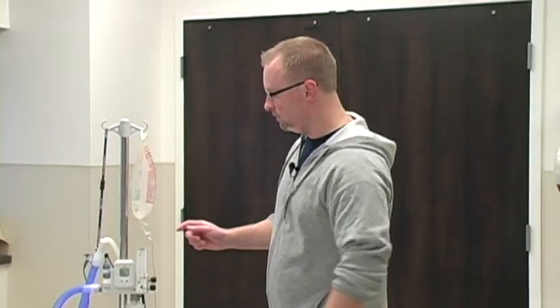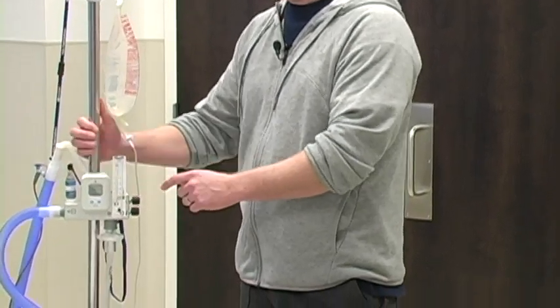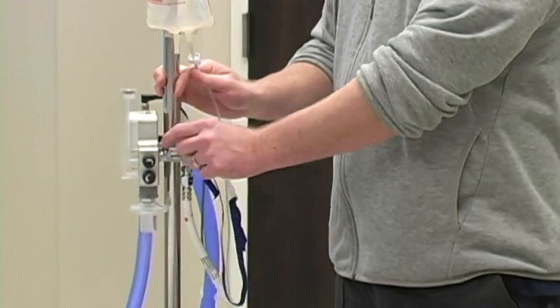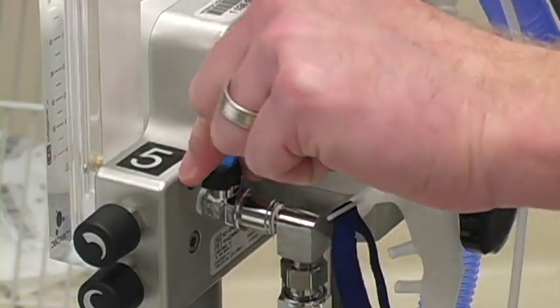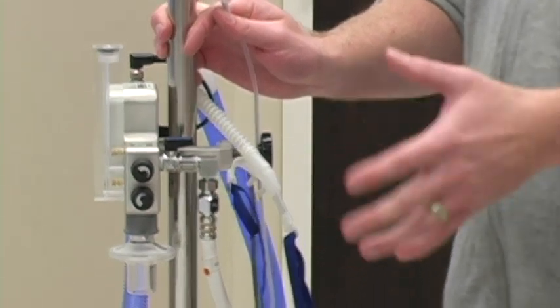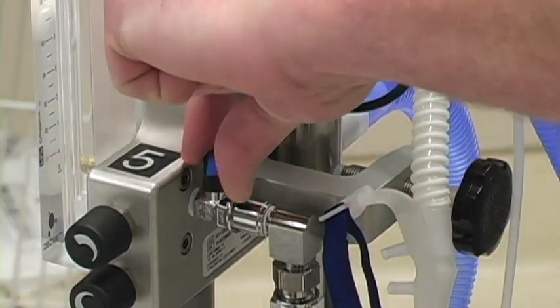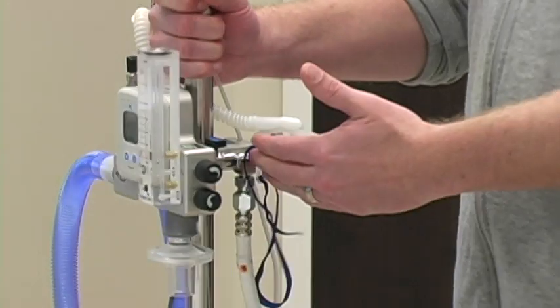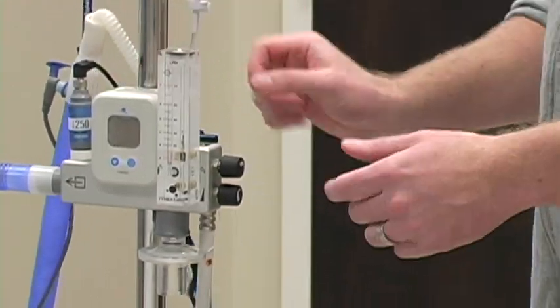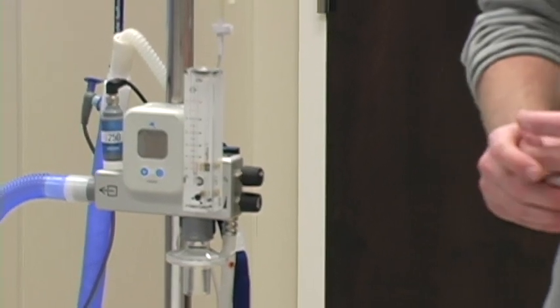The other thing to keep in mind though, instead of turning these dials down, as I mentioned, they're a little bit tricky to set up, there's a switch on the back, a little blue switch, and you would just switch it one way to turn it on, and you can hear that's what it sounds like when it's running. It's noisy, but not as noisy as our aerosol setup. And then you switch it back and it just cuts the flow to the machine. So everything goes quiet and is turned off. When you come back, you just switch it back on and it goes back to its previous settings. So it's very easy and simple to do.